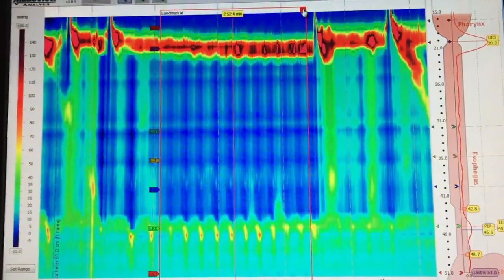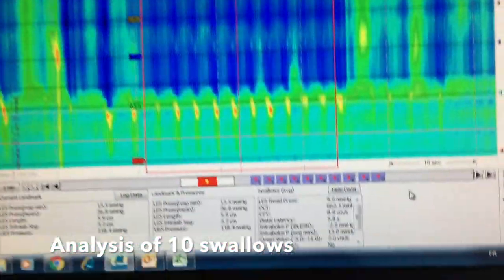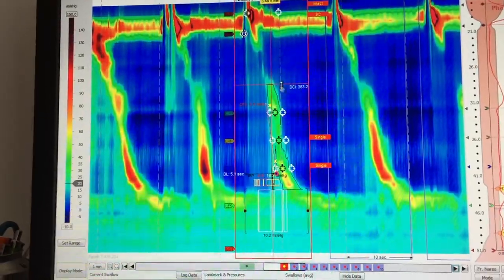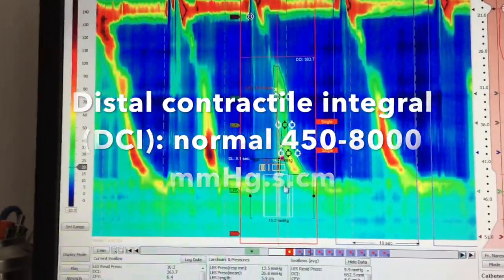I will look at the swallows. I move to the next swallow. Here the DCI is below 450, so this is an ineffective swallow; otherwise everything is normal.